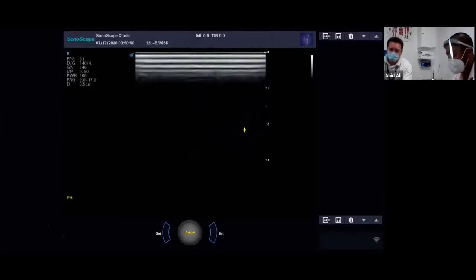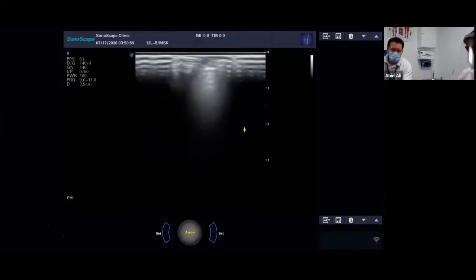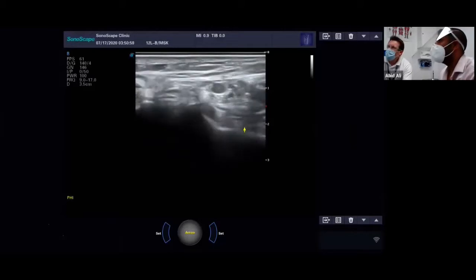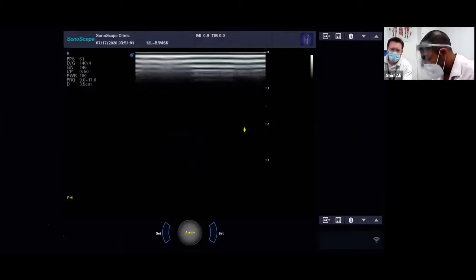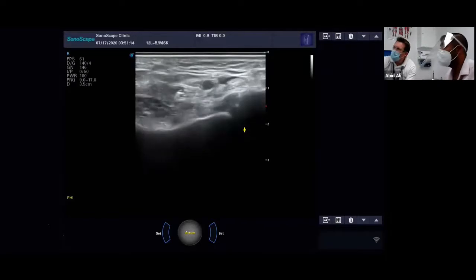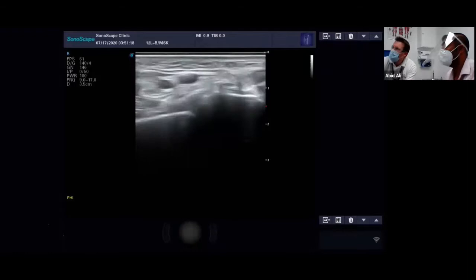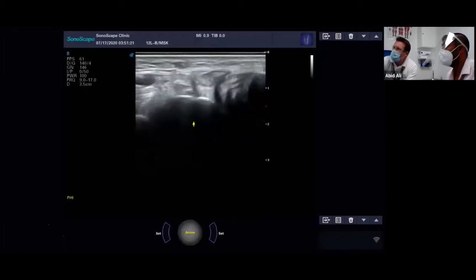I'll just very quickly show you the neurovascular bundle, but I think we're not far off time there. Let's just see where we are. Should we just show them the angle of the probe placement? So find the medial malleolus, and you want to draw an imaginary line between that and the calcaneus, and that is your probe position. So we're in the transverse plane here. Let's just make sure we've got a bit of bone in the picture.